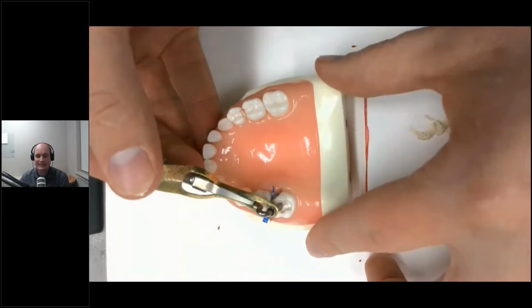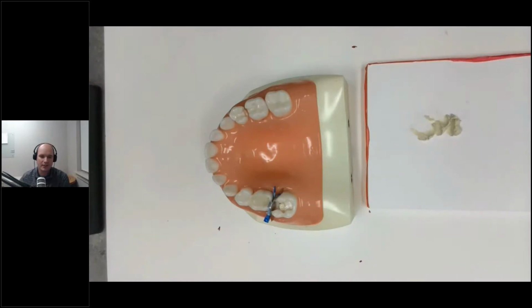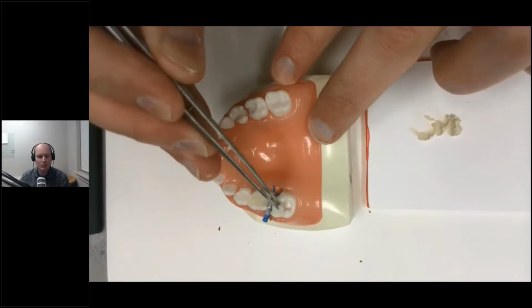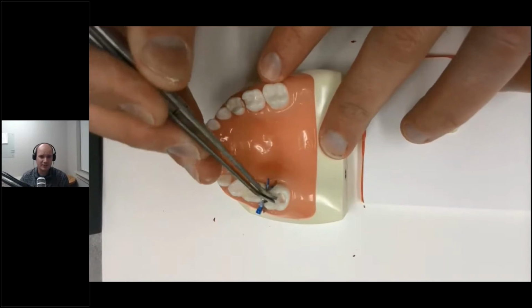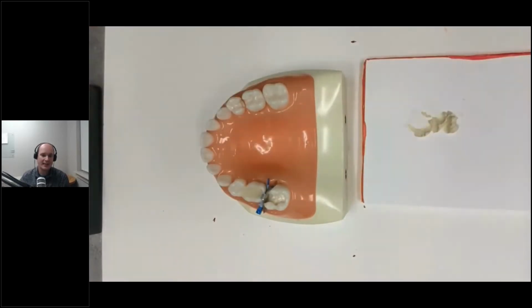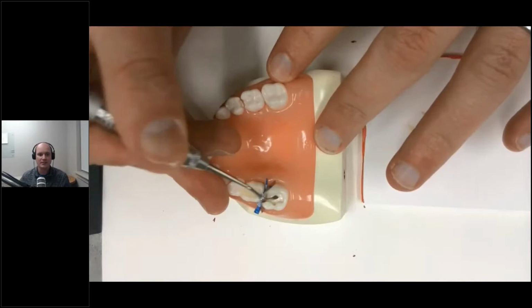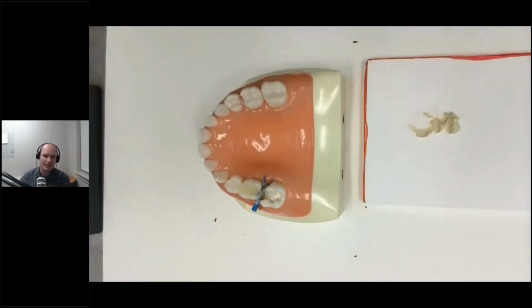Here, this is actually Biodentine in this case. I usually disinfect, I didn't show that, with 6% sodium hypochlorite. Go ahead and place Biodentine, or another calcium silicate, another MTA product, with an amalgam carrier, and then condense that with just a very moist cotton pellet so it doesn't stick to it. You want to go ahead and let this set for the 9 to 12 minutes if you're going to use this material. And then you can go ahead and do your, I didn't show etching, but you can do your etching, your bonding right over this material.